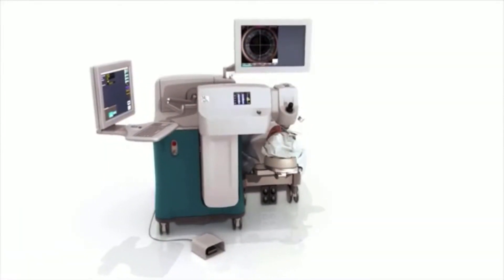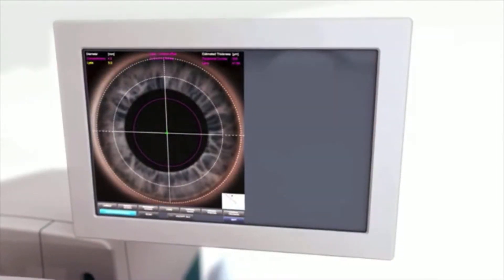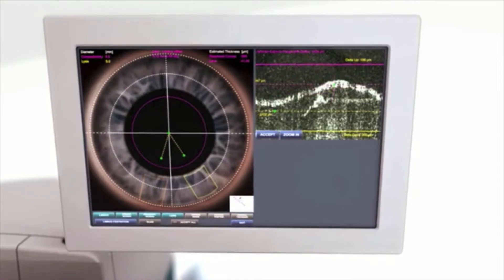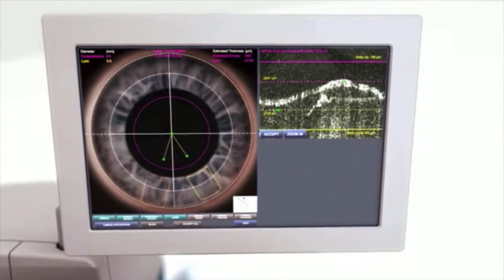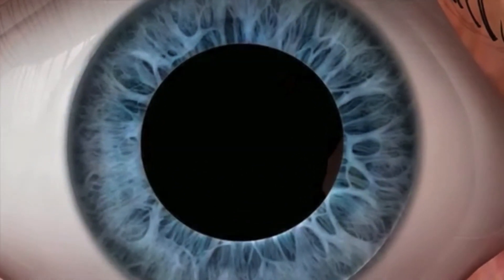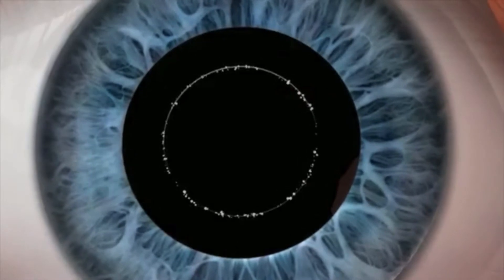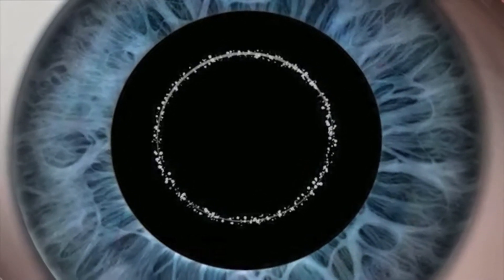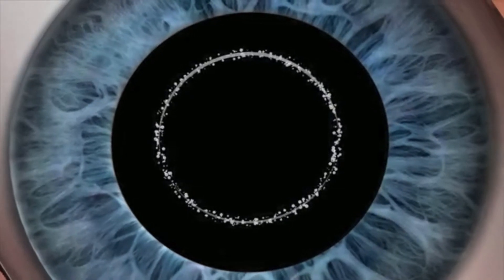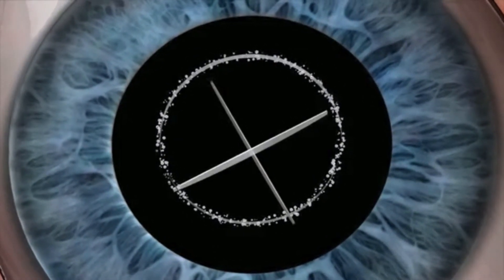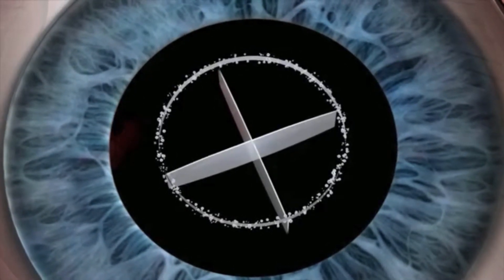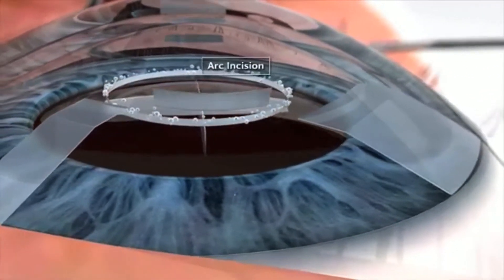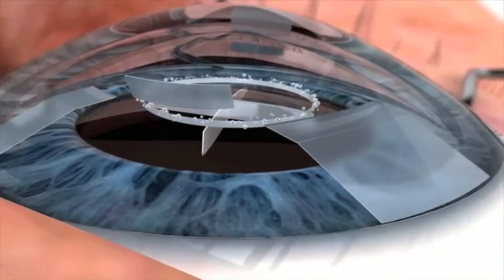The femtosecond laser brings a new level of customization to cataract surgery, allowing each procedure to be tailored to patient anatomy and surgeon preference. The video microscope allows us to use the patient's eye to program laser settings. First, the capsulorhexis is performed, creating a circular opening in the anterior capsule of the cataract — traditionally performed freehand by the surgeon, but the laser can make a perfect circle every time. The size and shape of the capsulotomy impacts the position the IOL will take. Next, the laser fragments the cataract into easily dissected quadrants for easier removal with less ultrasound energy. Finally, the two incisions needed to manipulate and remove the cataract are created by the laser, setting the table for easier cataract removal.